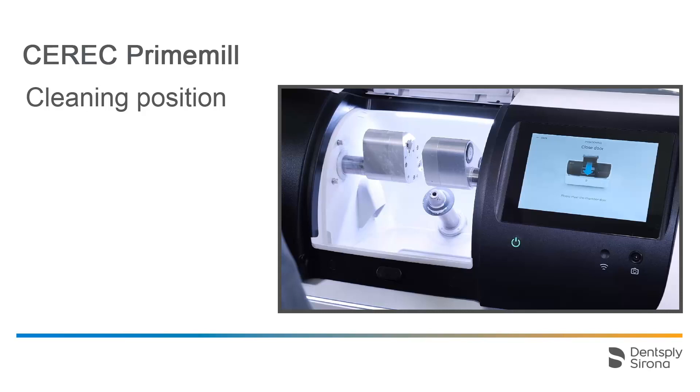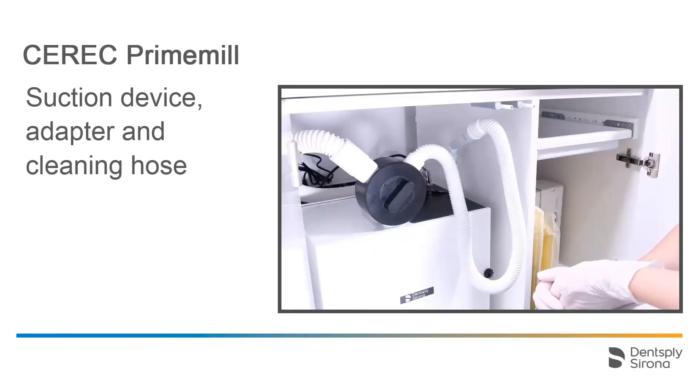Next, we will show you how to set the suction unit so that the chamber can be cleaned with the new cleaning hose. The suction device, the black switch, and the cleaning hose are not included in the standard delivery of the CEREC PrimeMill and can be ordered separately. To begin with, the suction unit should be turned off.